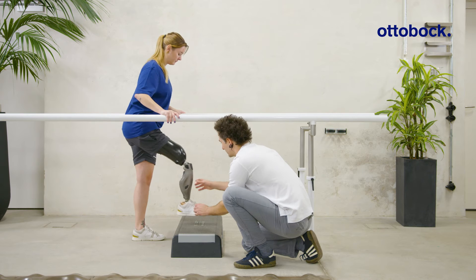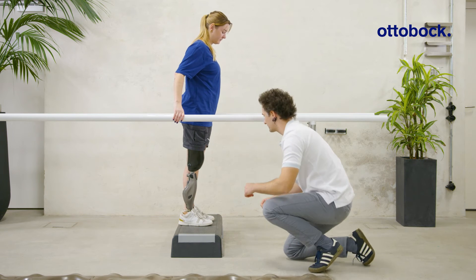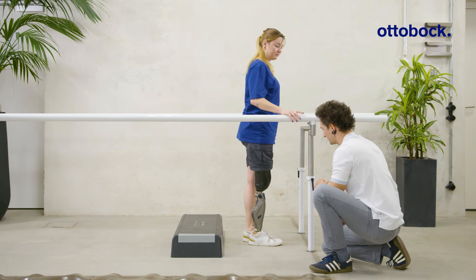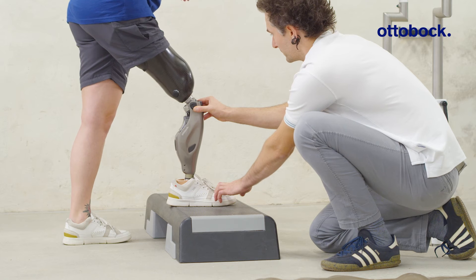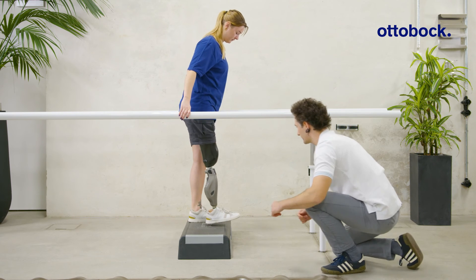By flexing the hip, the leg can swing forward to position the foot. The knee joint locks against flexion as soon as the prosthesis is loaded again. Now the user can load into the prosthesis and extend their hip to climb up to the next step.